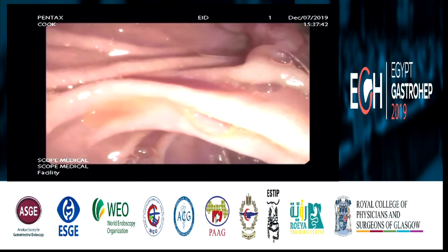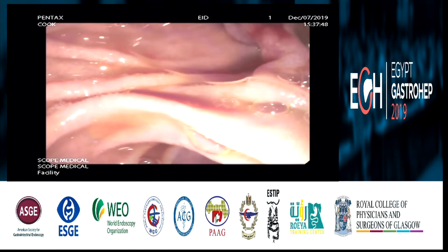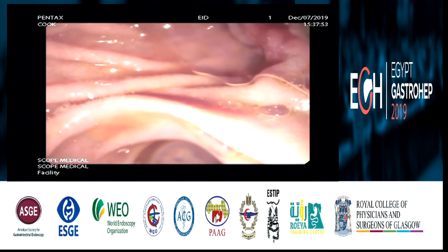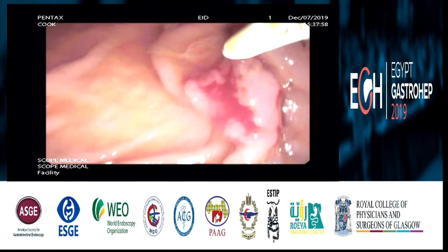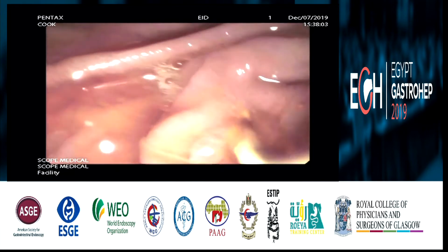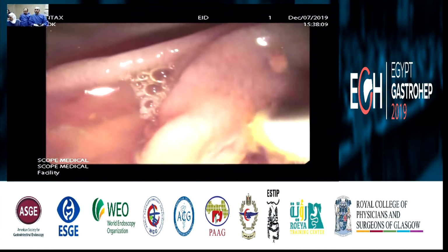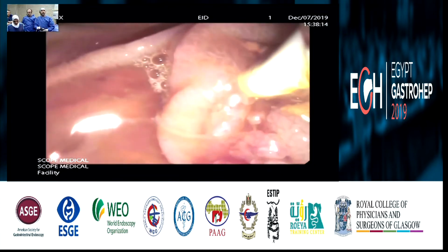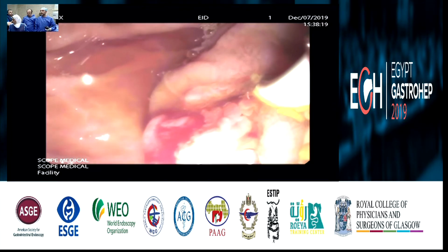And I just removed the 7 French stent, and we will try to do cholangiography just to see what is the situation, because this stricture was shown to be just on the level of the bile duct. Is it flushed with contrast? Okay, we are going with a wire now just above, and then we will inject some contrast just to see how is the situation and to understand better the type of the stricture.